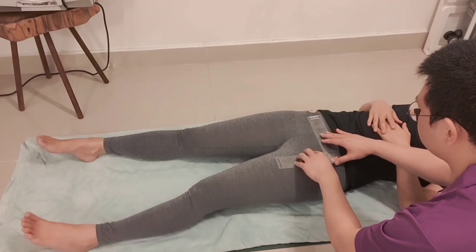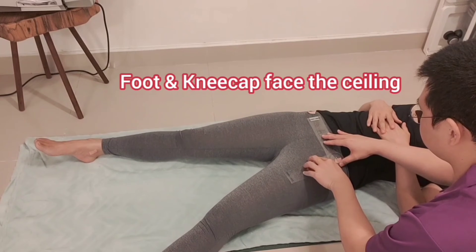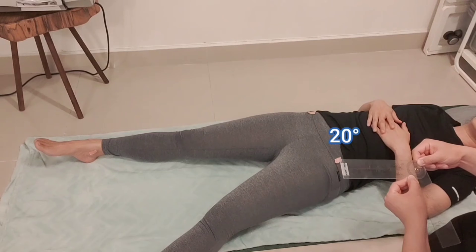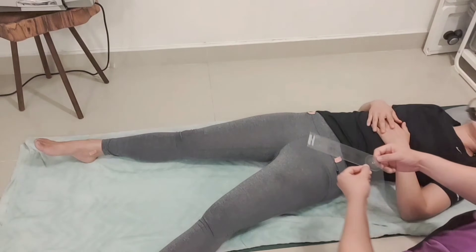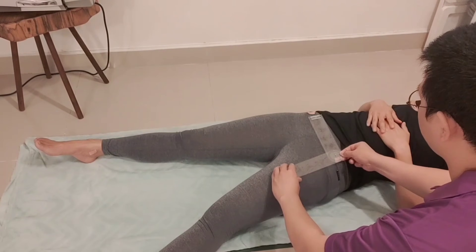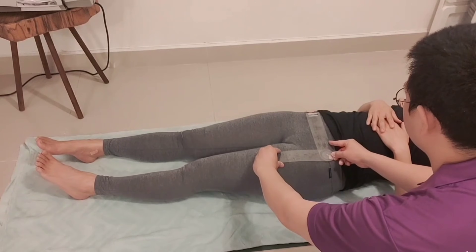Perform abduction of the hip joint. The patient's foot and kneecap should face the ceiling during the measurement — be careful not to externally rotate the patient's foot during the measurement, because if the hip joint is externally rotated during the measurement then we cannot get a proper result.